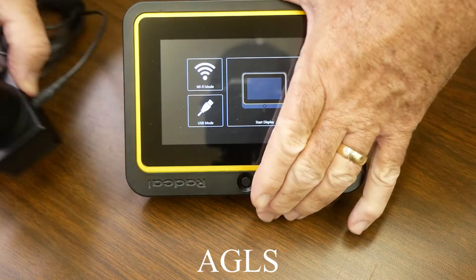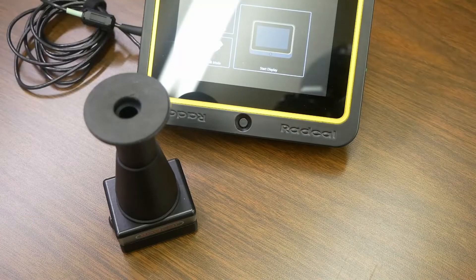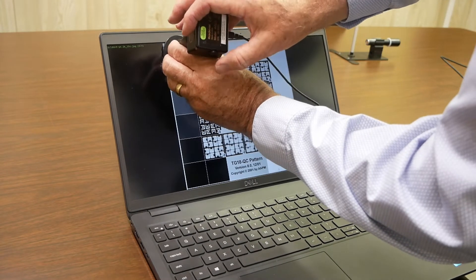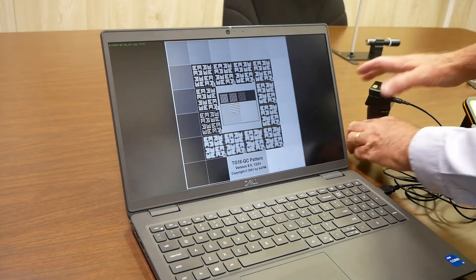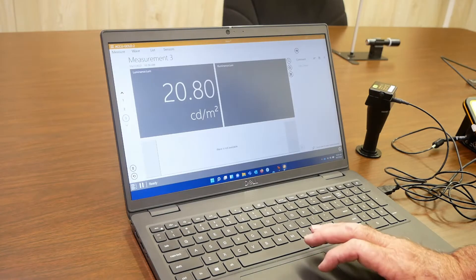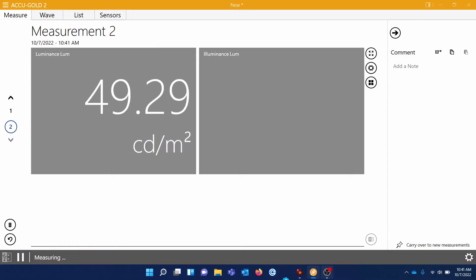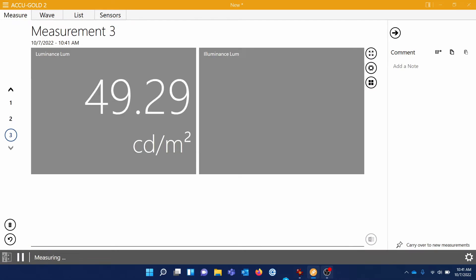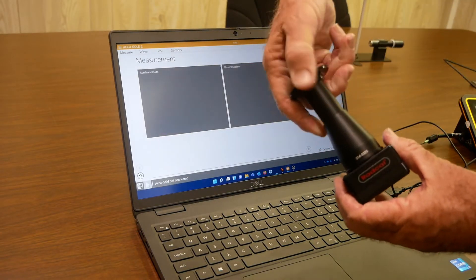The light meter can measure both luminance and illuminance. To measure luminance, we will measure sections of the monitor using a test pattern. To measure illuminance, we will remove the adapter to measure the ambient light in the room.